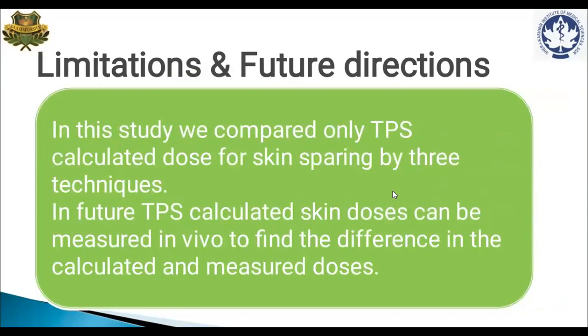Of course, limitations are there. And there is a future scope also. The limitation of this study was that we have only compared the TPS calculated doses for skin sparing by three techniques. In future, TPS calculated skin dose can be measured in vivo to find the difference in the calculated and measured doses.